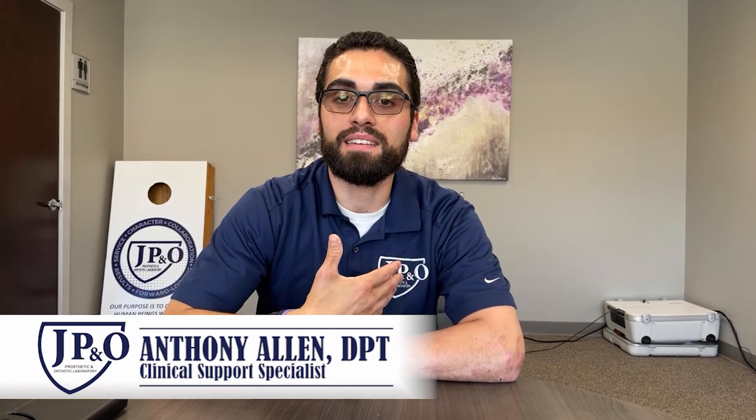Hello, everybody. My name is Anthony Allen. I'm the Clinical Support Specialist at JP&O and a Licensed Physical Therapist. Today, I'm here to tell you about our 3D L.A.S.A.R. Posture apparatus.